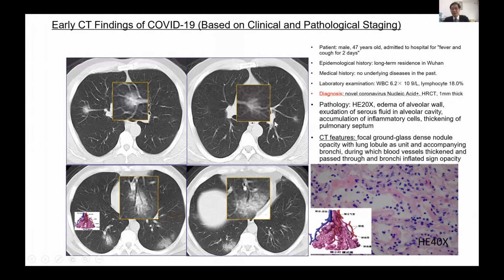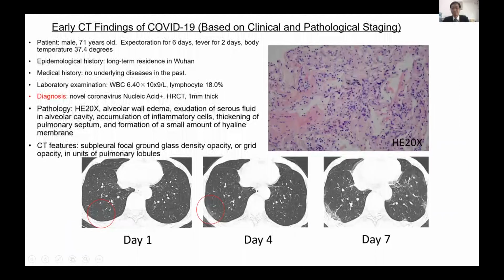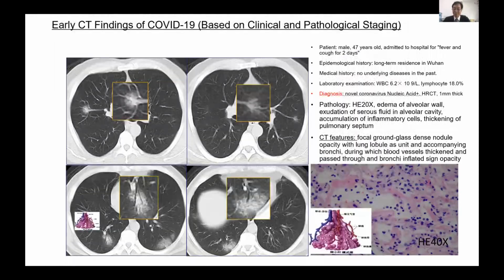The CT feature, you can see this one, this one, this one, this one. Bronchial inflation sign of CT.